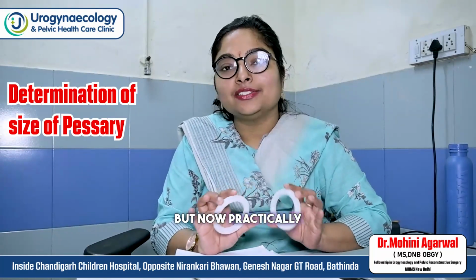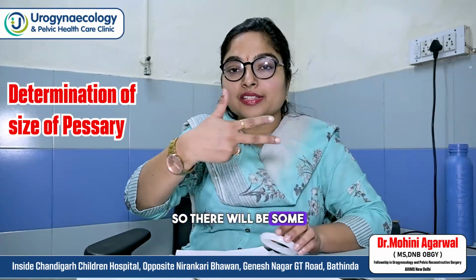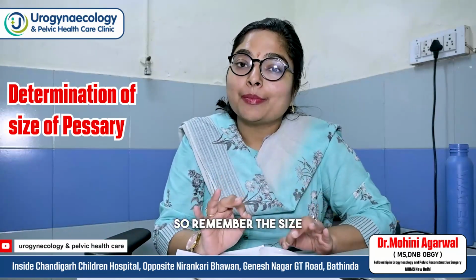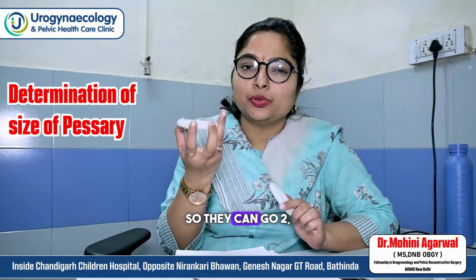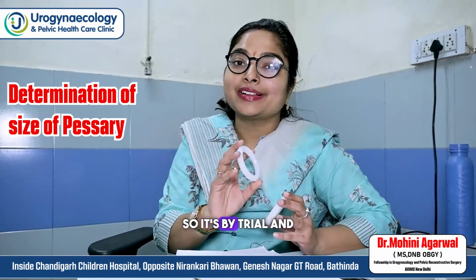But practically it is not possible. When you take the finger out of the vagina, there will be some change in the distance. So remember, the size of the pessary you have to determine by trial and error. These are the 3-inch pessaries, and there are also 2, 2.5, 4, and 4.5 inches. So it is by trial and error.